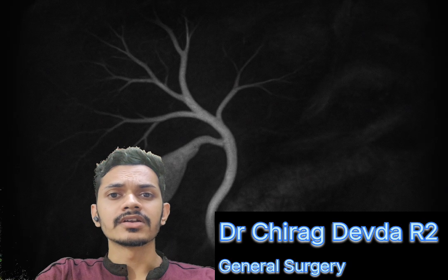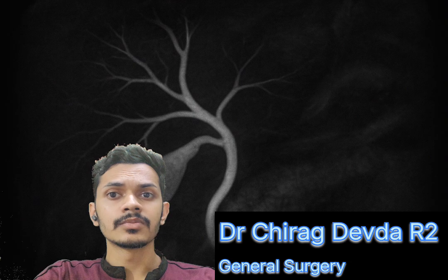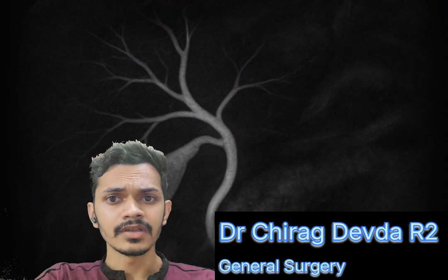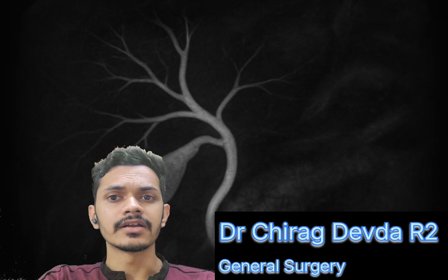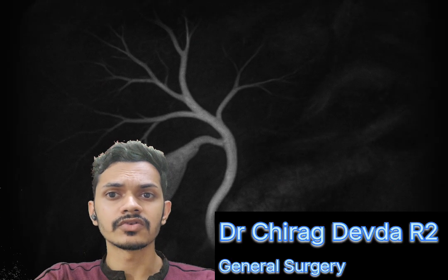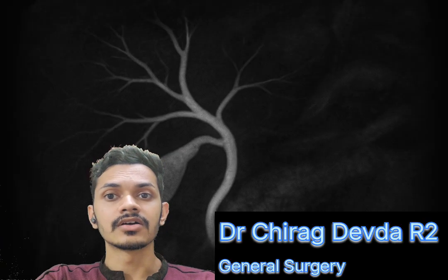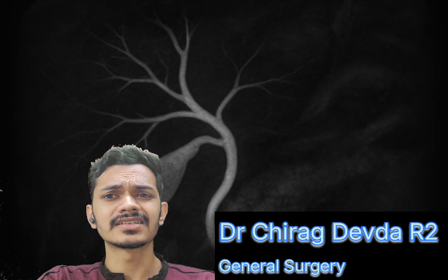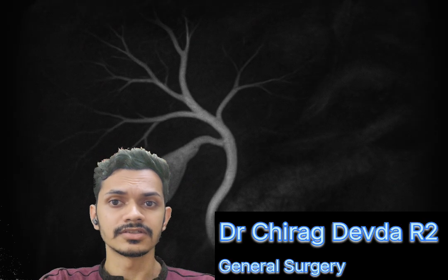An MRCP report includes a basic structure. It includes technique like T2-weighted MRCP, 3D reconstruction, and additional sequences if done. In the report, it includes biliary tree findings like ductal dilatation with measurement, presence and location of filling defects for stones, tumors, stricture, length of stricture and morphology, anatomical variants, and evidence of extrinsic compression. In the gallbladder, it finds stones, wall thickening, masses or sludge.